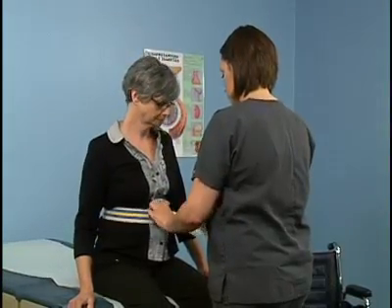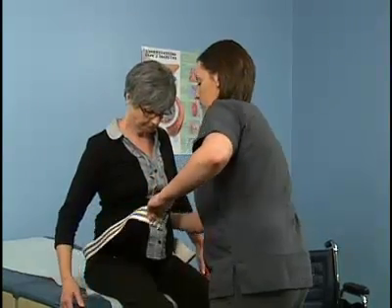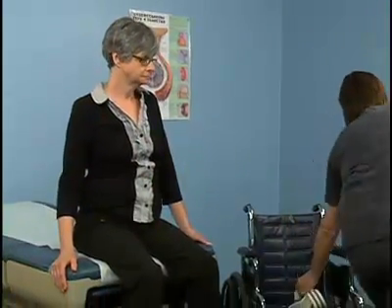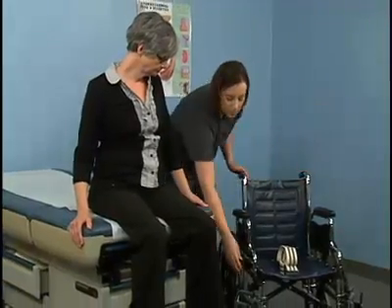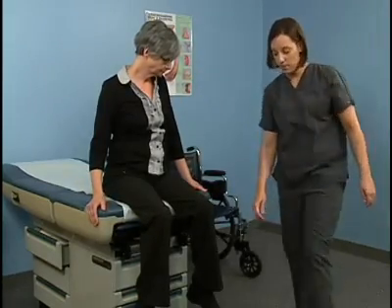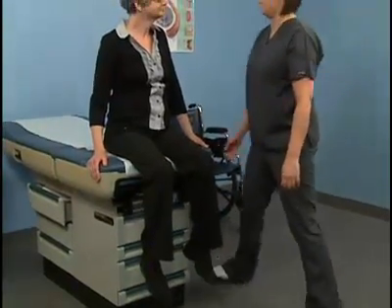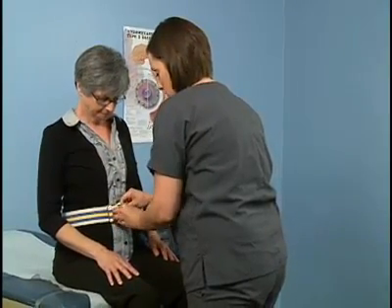Remove the transfer belt. Unlock the wheelchair and move it out of the way. Push in the footrest of the examining table. Stay with the patient to prevent falls. When the patient is ready to return to the wheelchair, put the transfer belt back on.